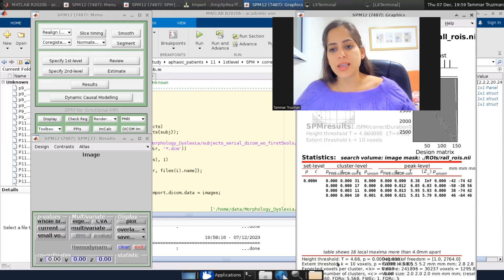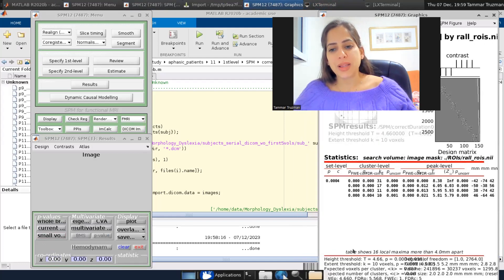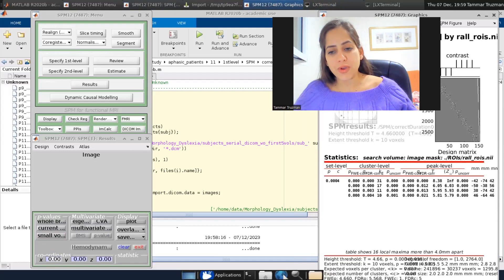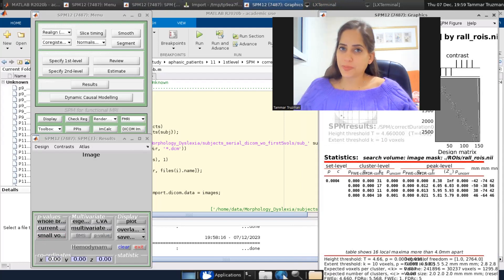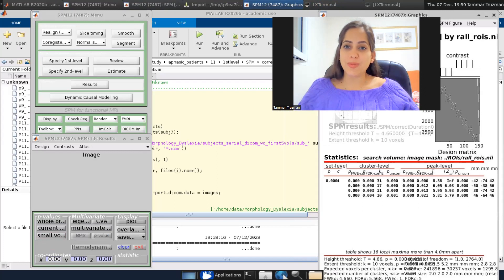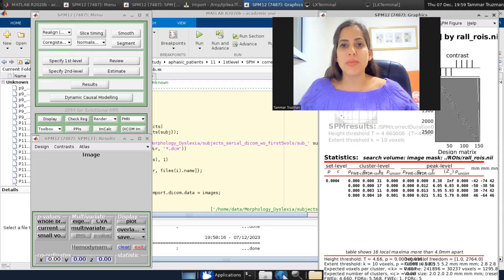So you can see, this is our high threshold. This is also the correction we applied only for our VOI. And you can see the results are very restricted to specific regions that were within my VOI.